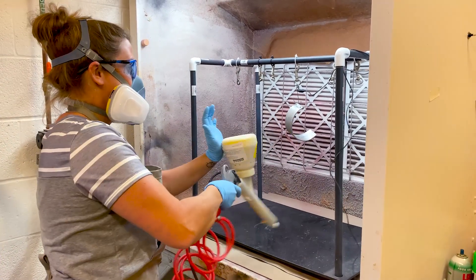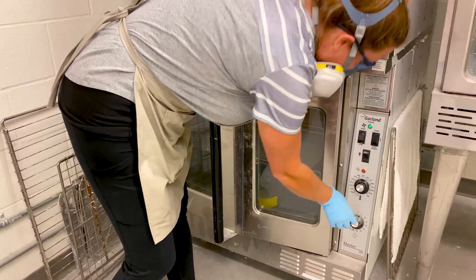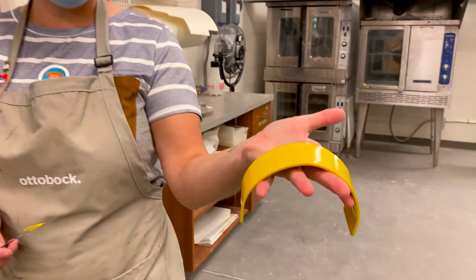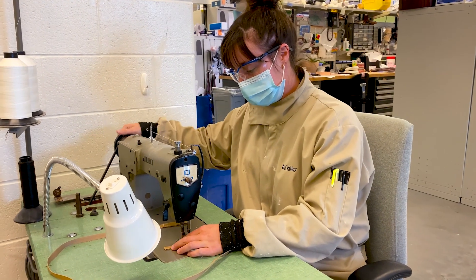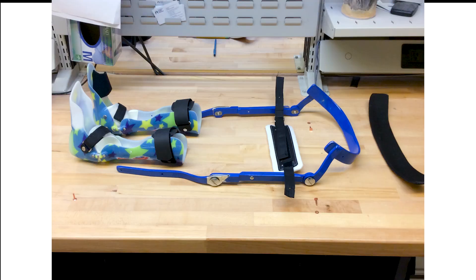The colored powder is sprayed through an electrostatic gun, which negatively charges the powder. The metal being colored is grounded, which attracts the powder to it. Then the metal is heated, which melts the powder, forming a hard coating. The last step is sewing straps and adding padding to make the pelvic band more comfortable. Then it gets assembled to create this functional HKAFO masterpiece.